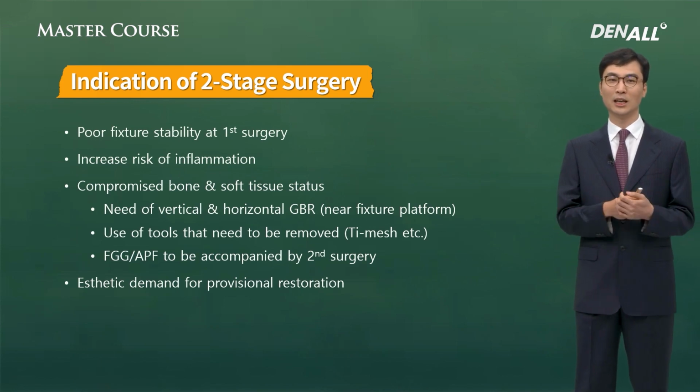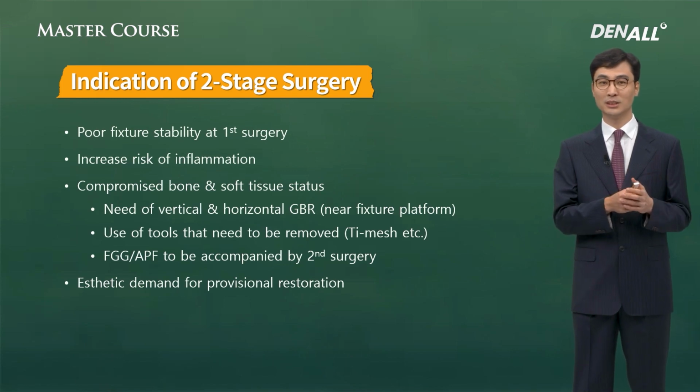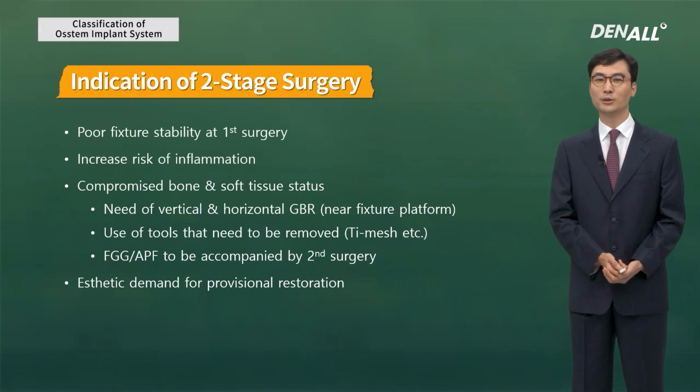So depending on situation, submerged type or non-submerged type implants need to be used.